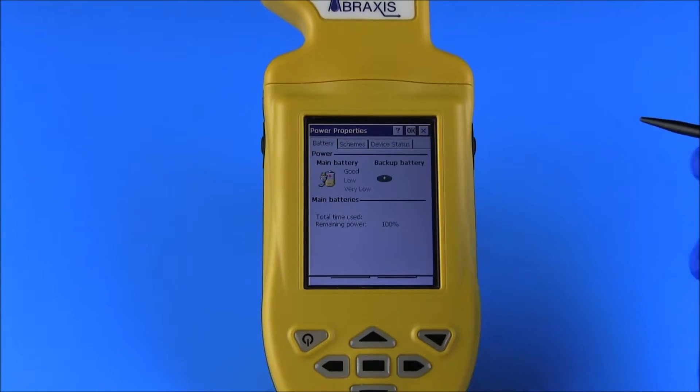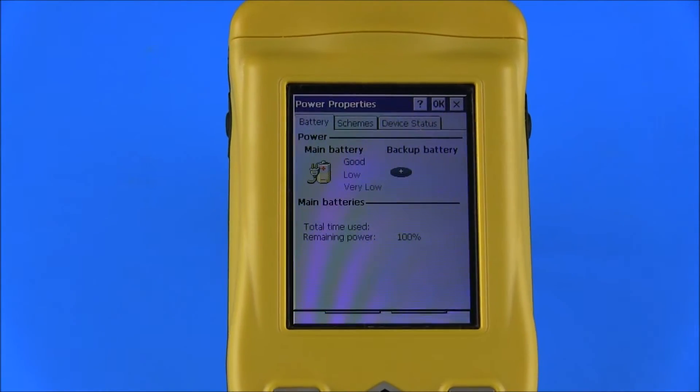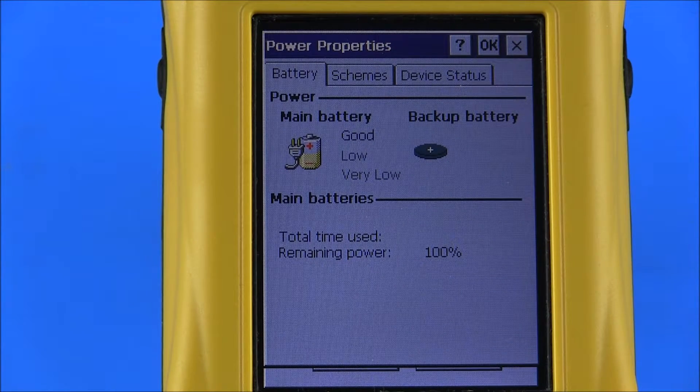A series of icons are displayed to the right of the user control menu in the top right corner of the display screen. The connection status icon is displayed only when the reader is connected to a computer via the USB cable, indicating that the unit is ready to transfer data to the desktop. The Power Properties icon indicates whether the reader is charging, indicated by the AC power icon, or using the main battery, indicated by the battery icon.